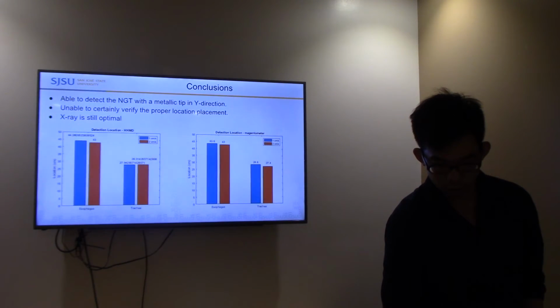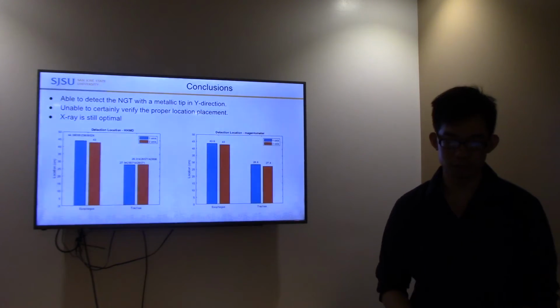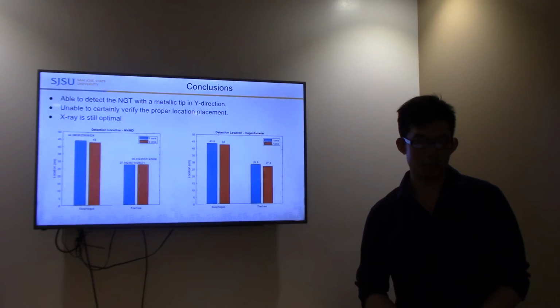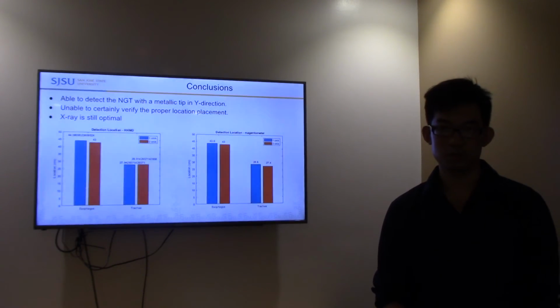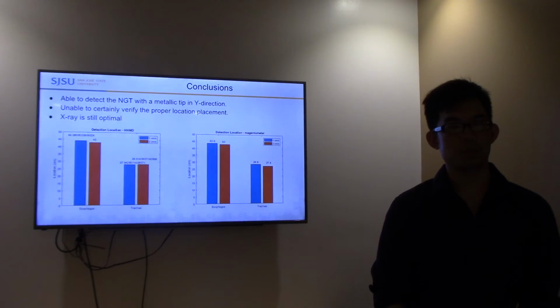Right. So with this data, I calculated everything. The red bar is 2 centimeters per second. I changed that into distance and calculated that it's around 43 centimeters for the esophagus. Okay, got it. And what's the spatial resolution of these two sensors? So if you want to essentially detect whether your tube is there or not, part of the idea is you want to see if it has gone away from where it's supposed to be. Is that the idea?